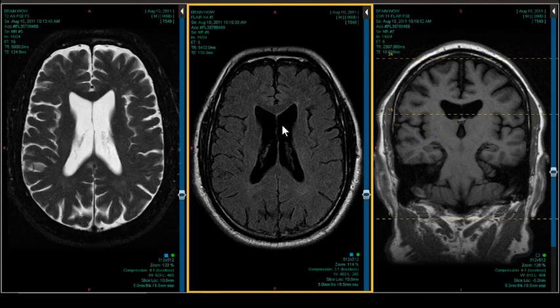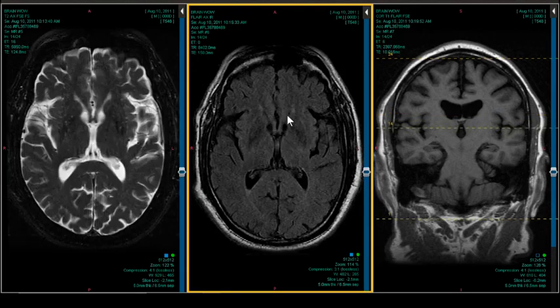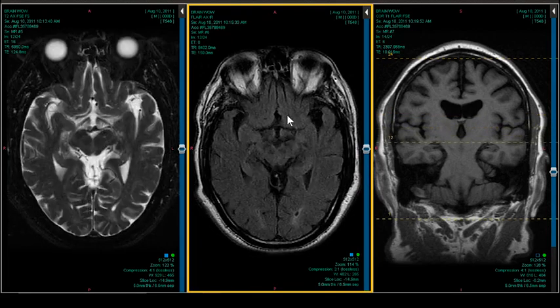But the point being, start thinking when you see atrophy. It's very easy to blow past this and just say central atrophy. And in that case, you will have done a disservice not only to this patient, but to his family. So when you start seeing that, I try to start categorizing in terms of distributions of things and try to give the clinician something to go on, okay? And this is a good case to get you started on that thought process.